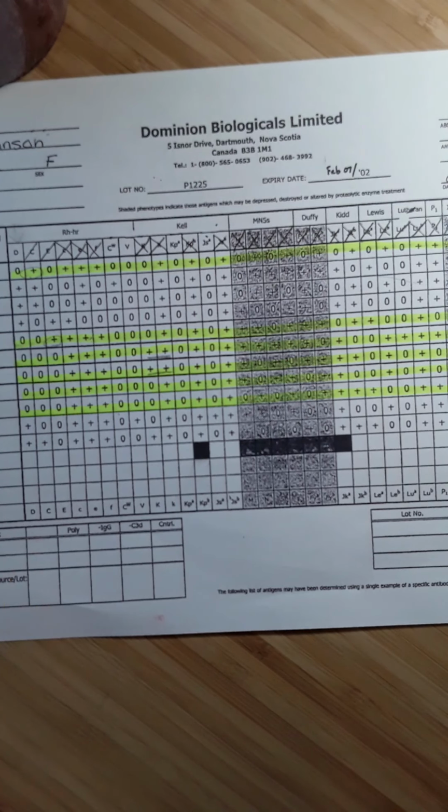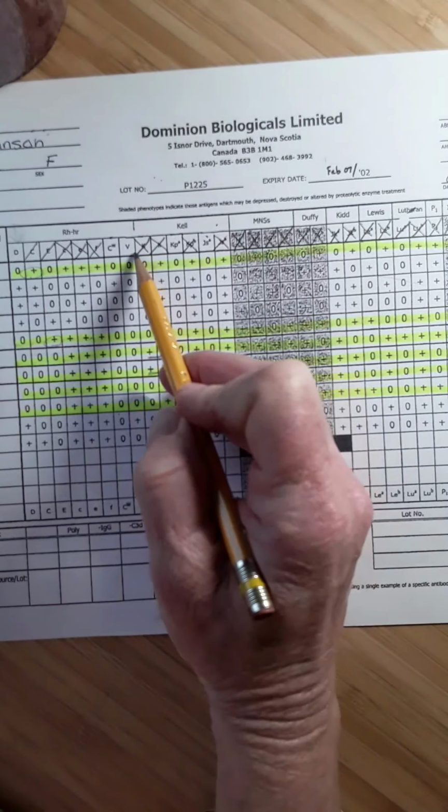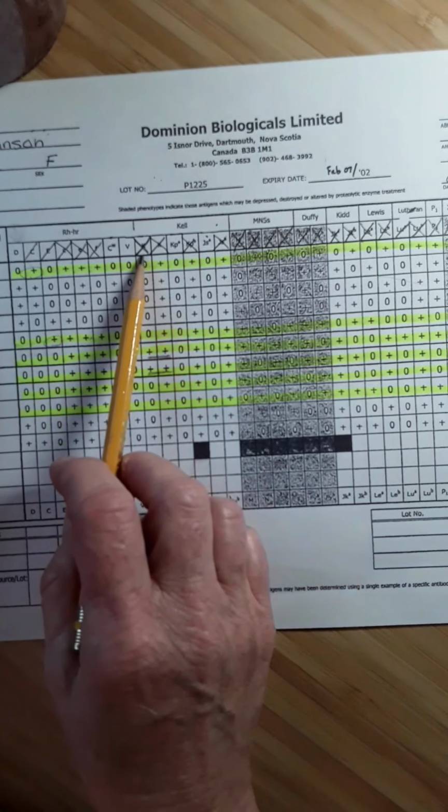So 3 Roman numeral 2 applies to Kel. For these antibodies, they can be excluded based on non-reactivity of the patient's plasma with at minimum 2 heterozygous cells. So indeed, I've got 2 heterozygous cells. That's why I have a slash and then another slash on big K.